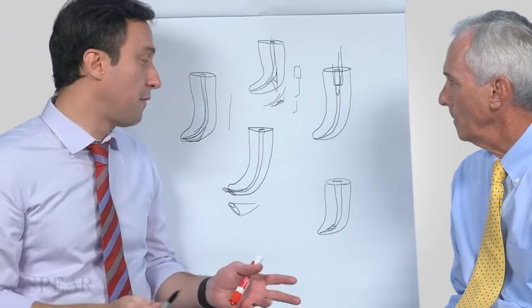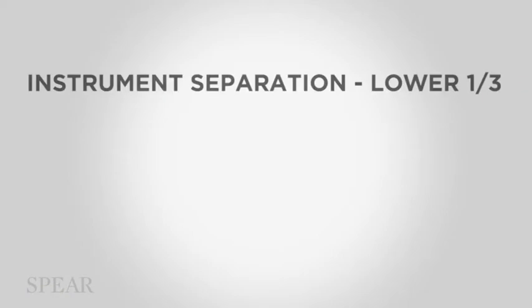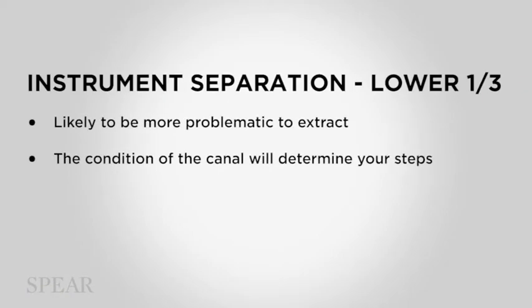So what do we learn from this situation? I mean, these might be removable up until the curve. Beyond the curve, I think you reach a point of diminishing returns. By trying to remove them, you end up destroying too much tooth structure.